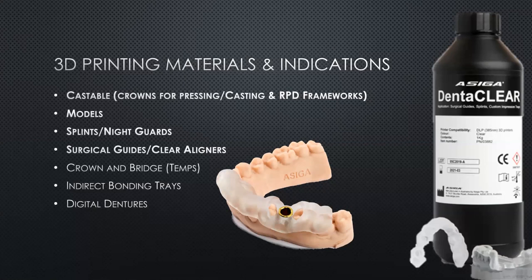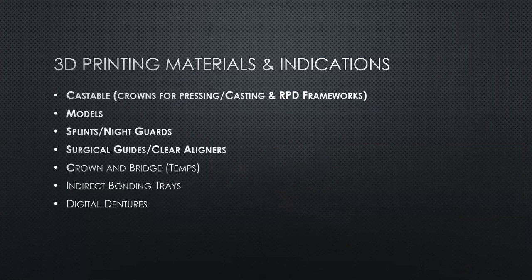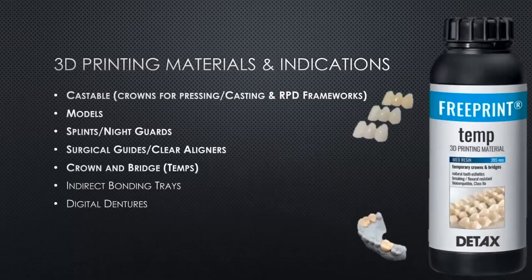Of course, the most popular application for digitally printed models in the world by far is for the fabrication of clear aligners.